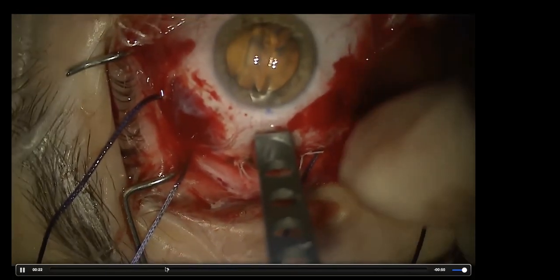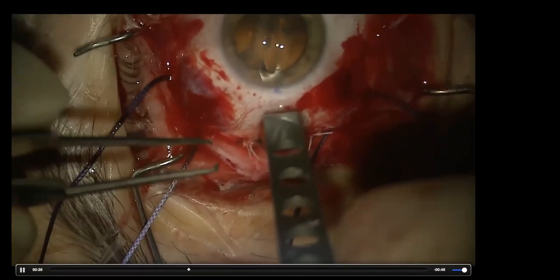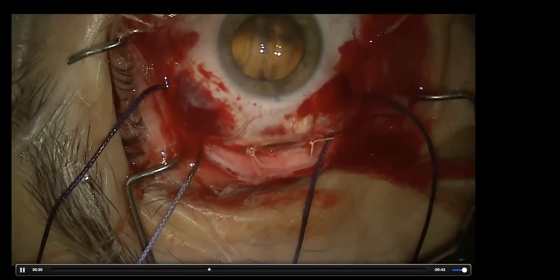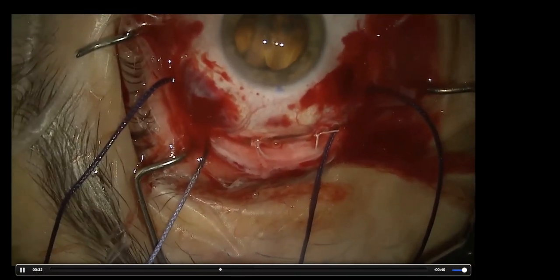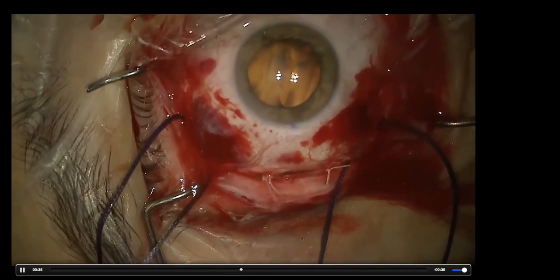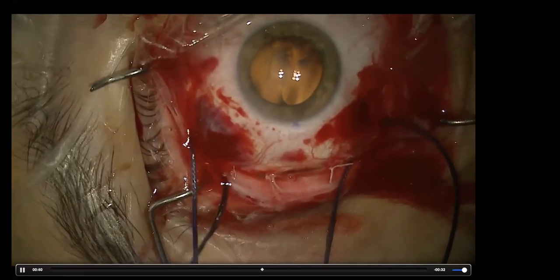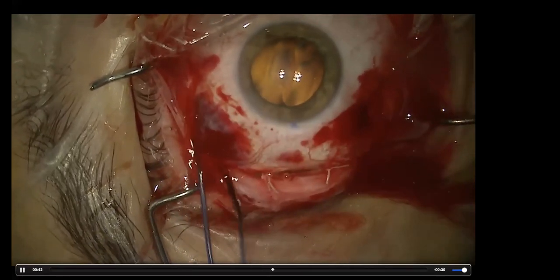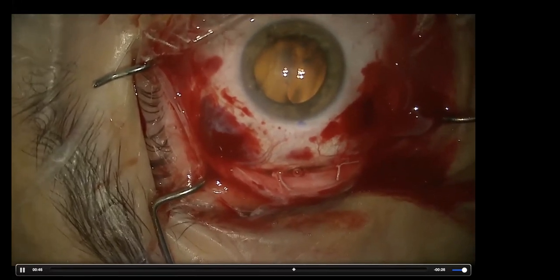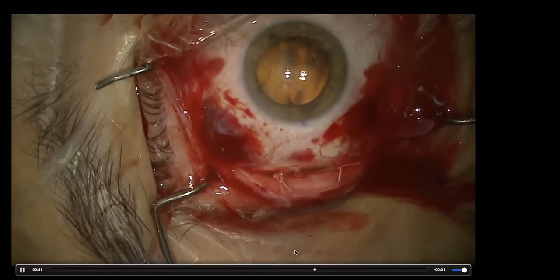It's easy. You see, to remove the loading device, you basically hold the buckle with the forceps, you remove the device. It's not necessary to remove the silicone sleeve that you use for the light. If you had used the light or to hold the buckle, you can leave it there. You remove the suture of the muscles, and then you close the conjunctiva.